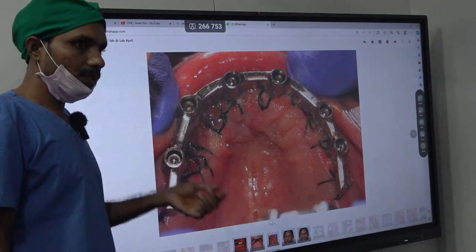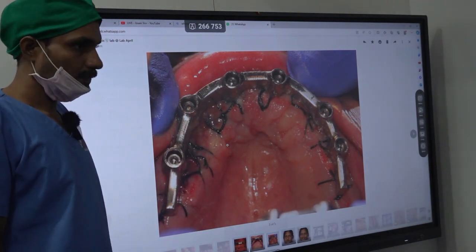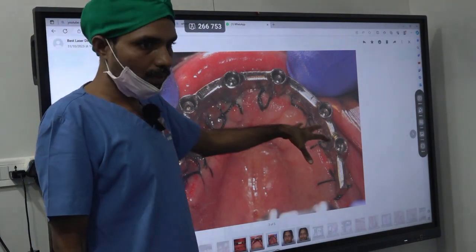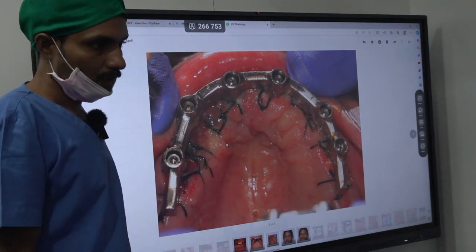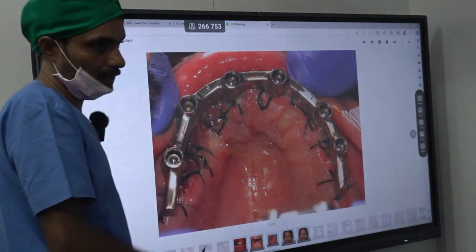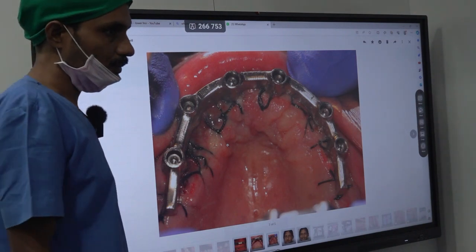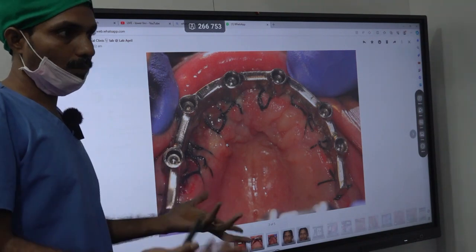But what we are doing in welding is only 1.2 mm or 2 mm. Do we take the entire arch also? Yes, same thing. Okay. So if you go for a bar, it is a kind of luxury treatment only. So you can reduce the number of implants, you can increase the cantilever. These are the advantages. See, why we placed 6 implants is, only 6 we can place in this case. If we can place 2 more here, we could have avoided the bar. So only in very essential cases we are doing this. So when we cannot place more implants, then we can shift on to this.